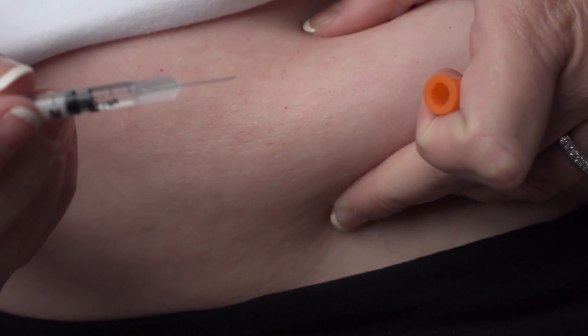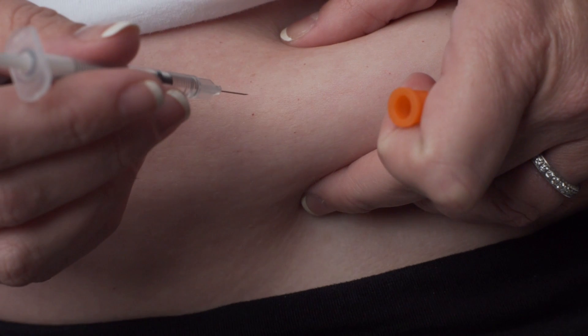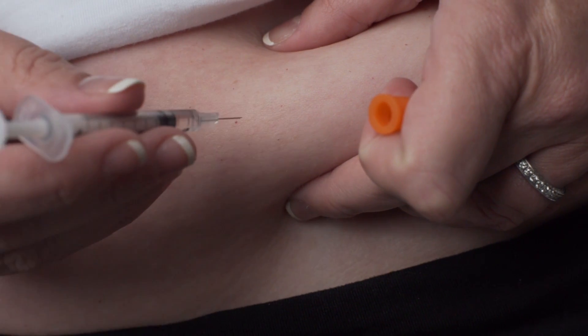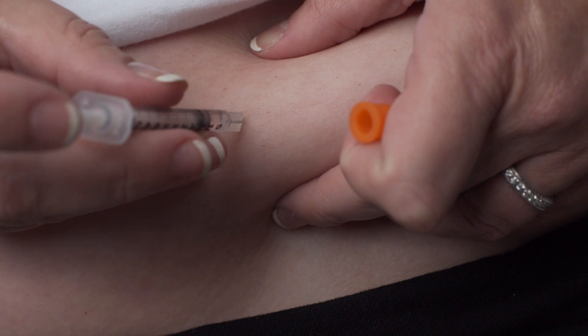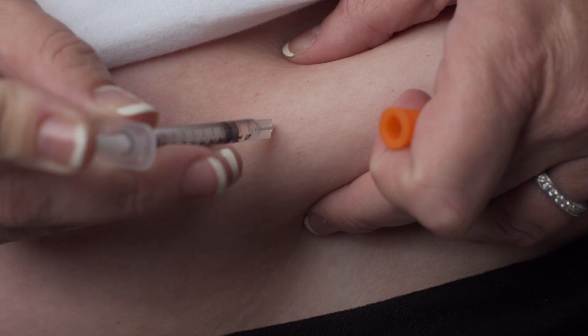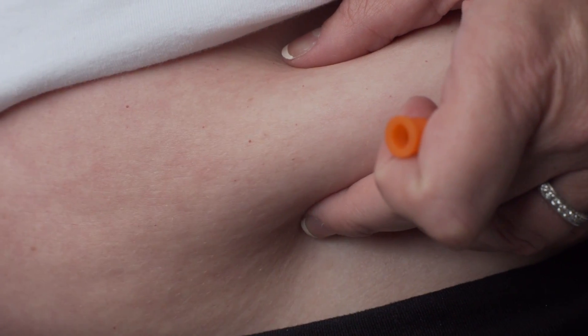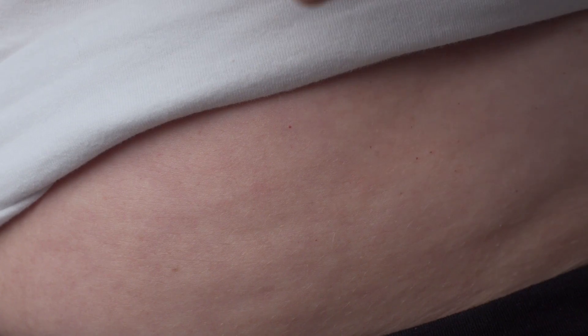Hold the syringe in your hand like a pen or pencil. With the other hand, gently grasp a small fold of skin between your thumb and index finger at the selected injection site. Insert the entire length of the needle into the fold of skin at a 45 to 90 degree angle. Once the needle is inserted, release the pinched skin and push the plunger in a slow, steady motion until all the medication is injected.